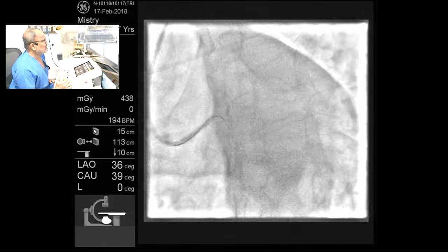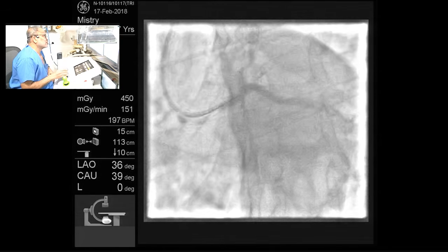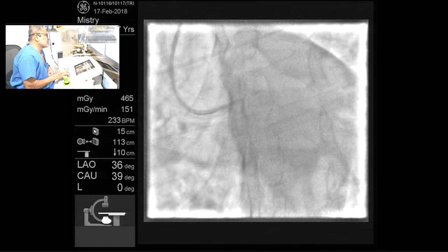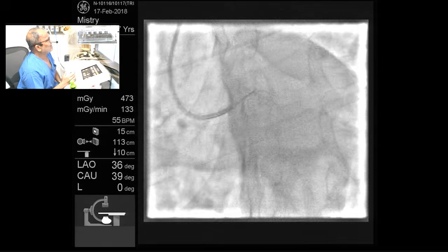I am withdrawing the guide a little bit. Yes, this is better. Just show me.